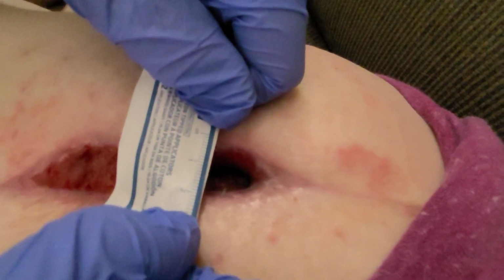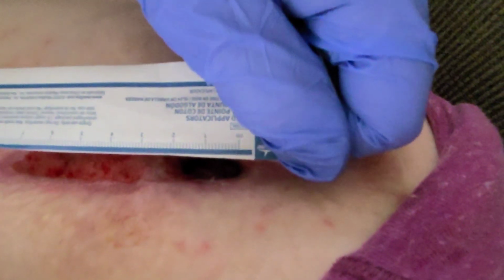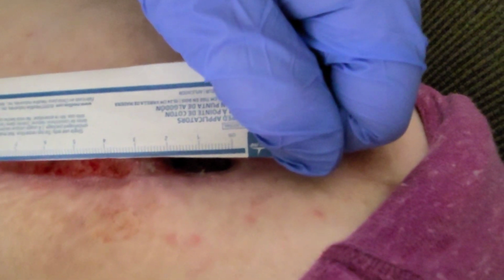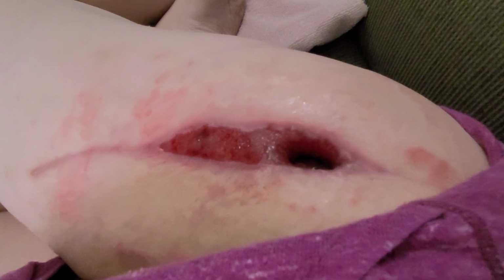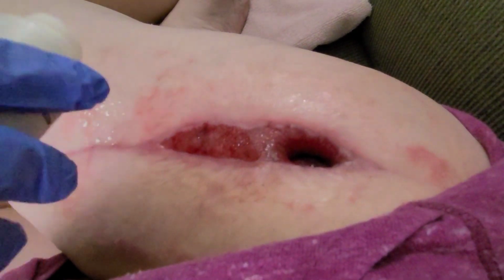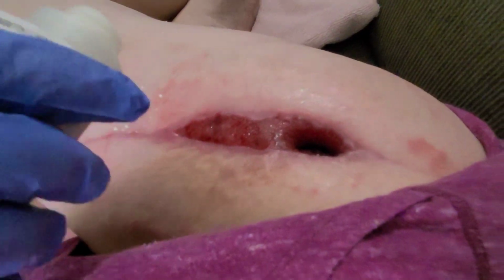Inside of each package, there is a paper ruler so that she can measure the wound and chart it to see how much it's healing each time. Now, she sees me 3 times a week, Monday, Wednesday, and Friday. And I tell you guys, it changes every single time.